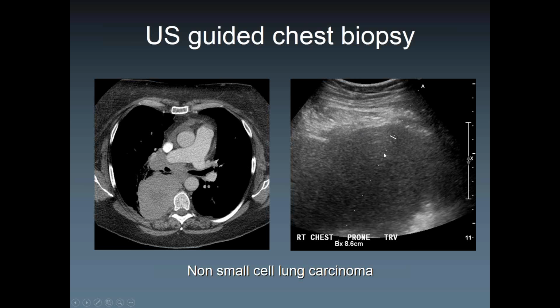However, with smaller lung lesions, you have another challenge. Small lung lesions, if they are subpleural, abut the pleura only to a very small degree, right? So the lesion is much larger than the contact zone would be. So in ultrasound, you would expect to see much more than just this portion here. And in this case, you could do it with ultrasound.